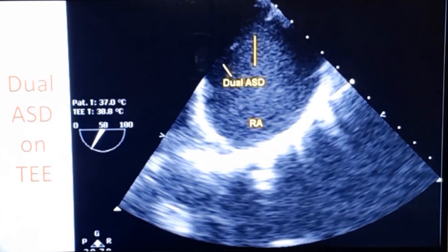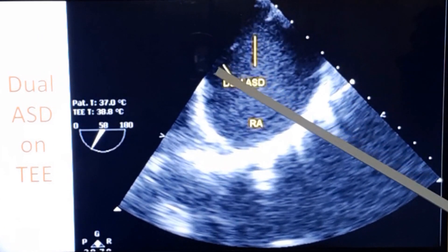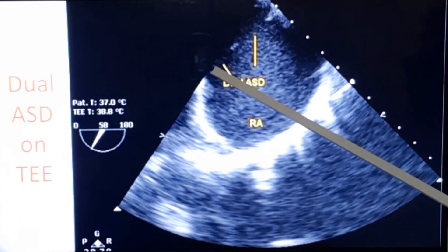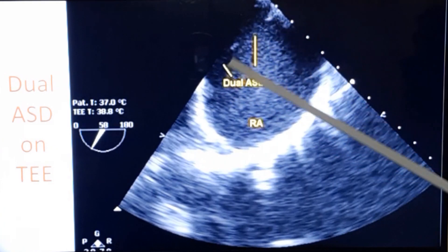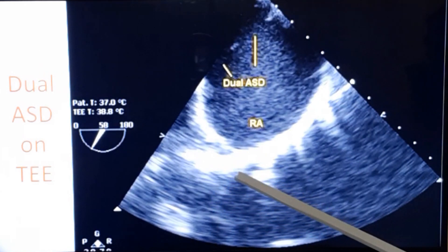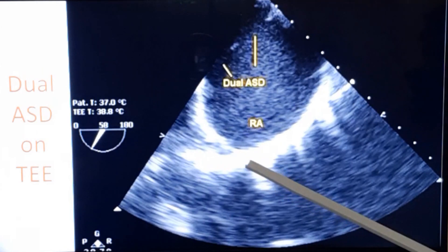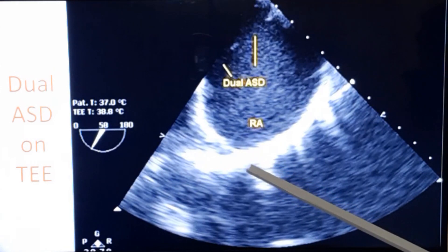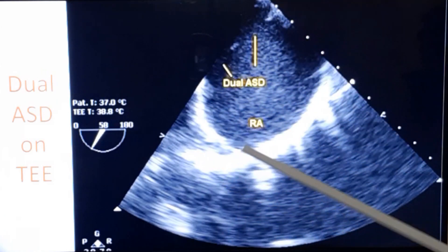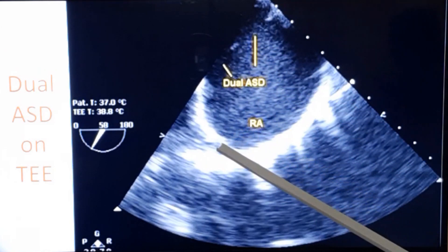Sometimes you can have more than one atrial septal defect. Here you can see one defect here and another defect here, with a small area of tissue in between — a dual atrial septal defect. The total length of the defect will be quite large for device closure, so this may not be an ideal case. For device closure, you need good rims all around and the size should not be too large. Here the rims are not very good, the size is too much, and there is intervening tissue which can all interfere with the device closure procedure.